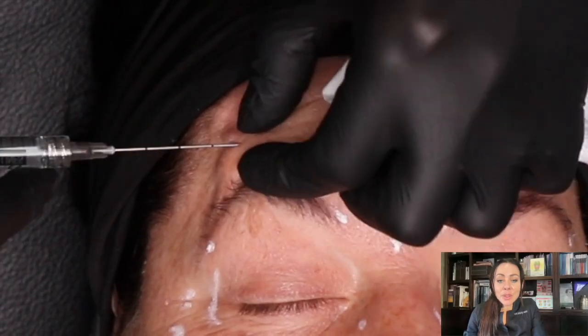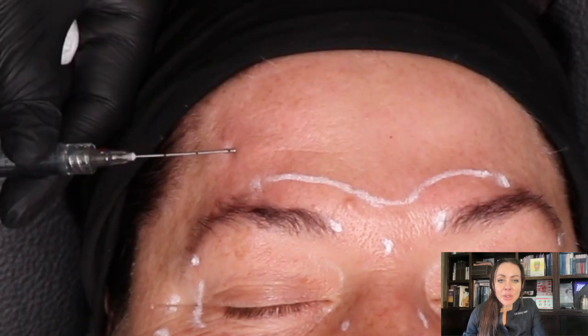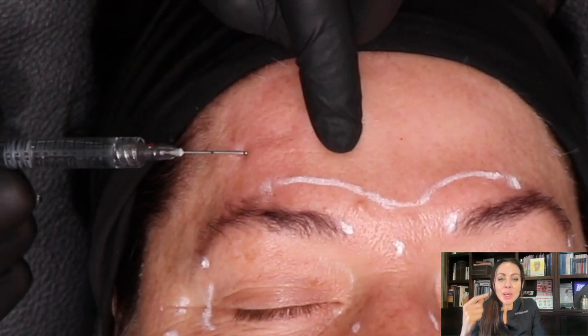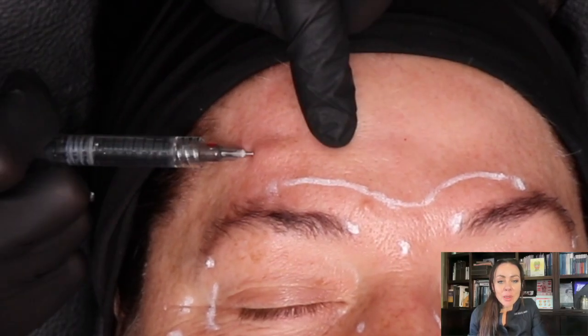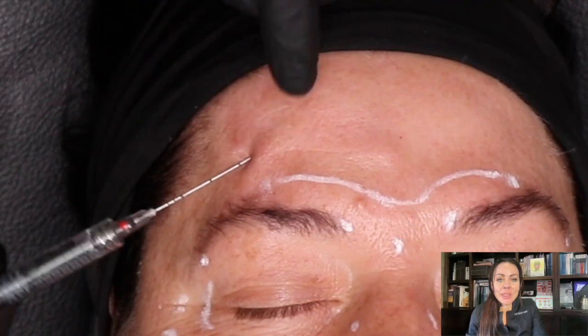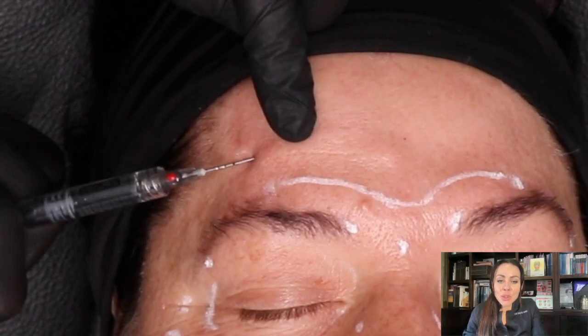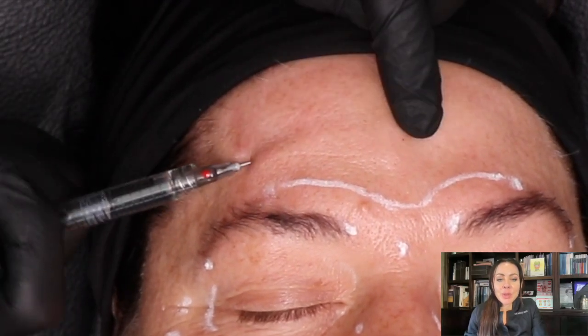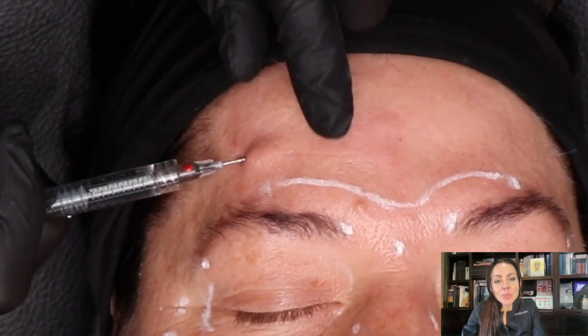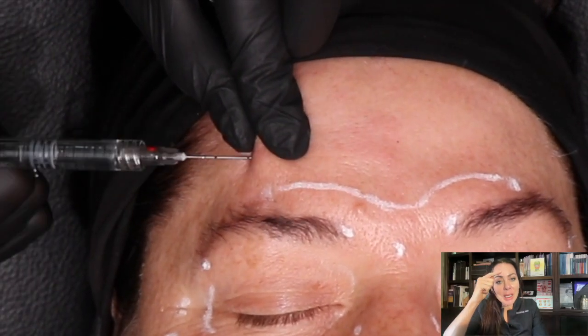We start with a 22 gauge 50 millimeter cannula, entering from the temporal crest about one and a half to two centimeters above the brow. We insert it underneath the frontalis muscle, working on the supraperiosteal plane — on the bone — using very slow steps moving towards the midline.